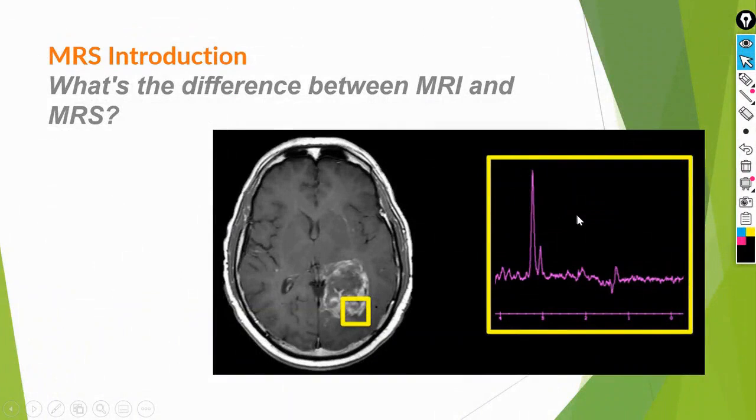Now let's talk about the last thing and the most difficult thing, just a little bit. So what's the topic of spectroscopy? I was just talking a little while ago and mentioned that all the atoms exhibit precession frequency.